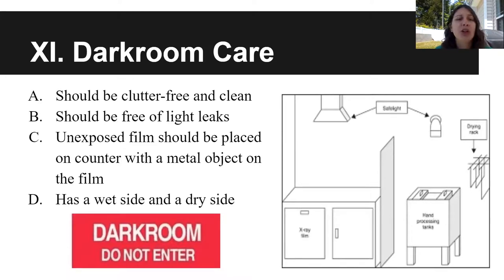The darkroom should be clutter-free. It should be clean because it's dark in there. You kick something that's not supposed to be in there, you're going to trip and you might fall on something that you don't need to be falling on. It should be free of any light leaks. You shouldn't have any light coming under the door. Definitely shouldn't have any windows or anything. You're supposed to be dark. It should be dark.